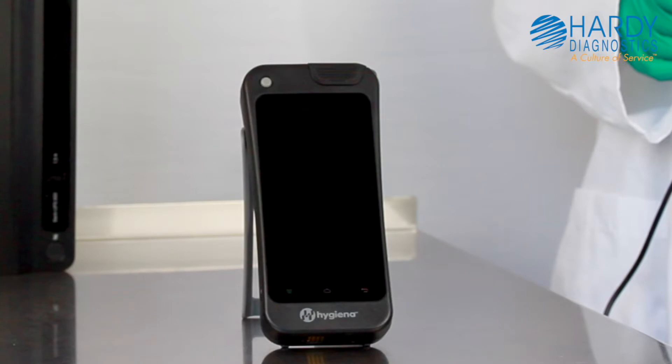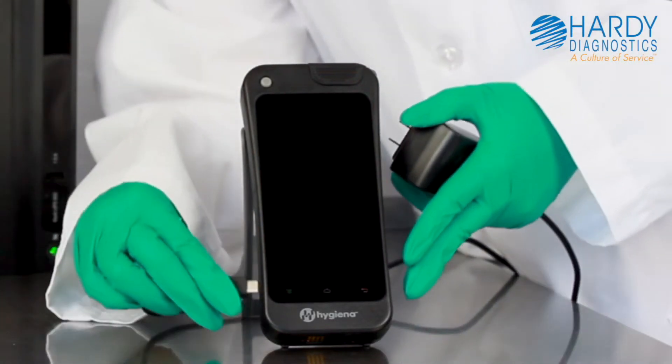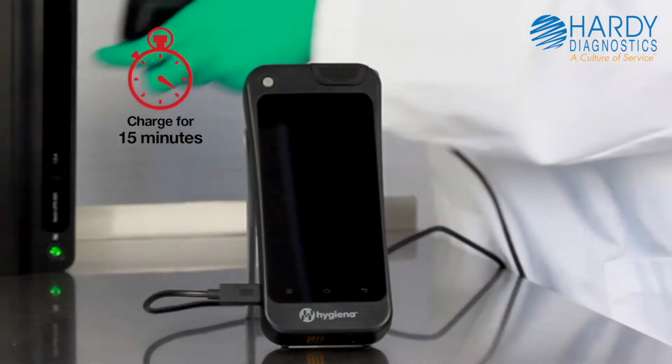Power and charging the Ensure Touch. Just like a smartphone, Ensure Touch is powered by a smart lithium-ion battery and uses a USB-C cable. Before using your Ensure Touch, plug it in and let it charge for 15 minutes.